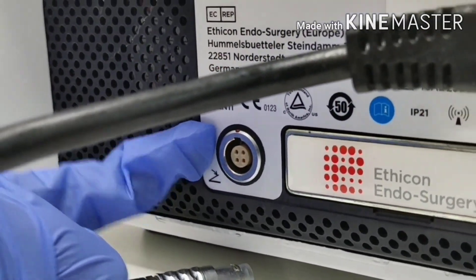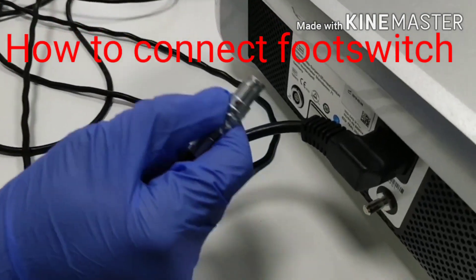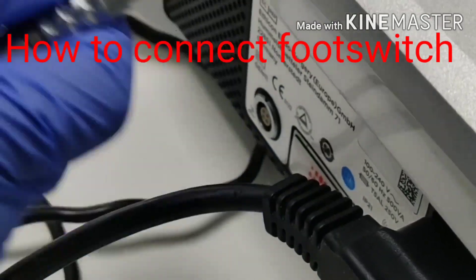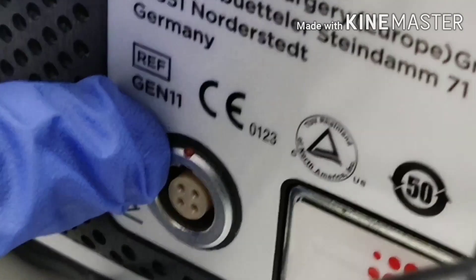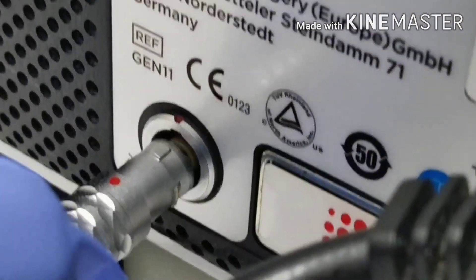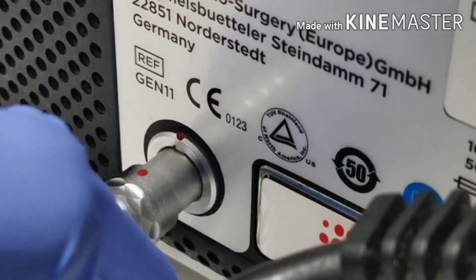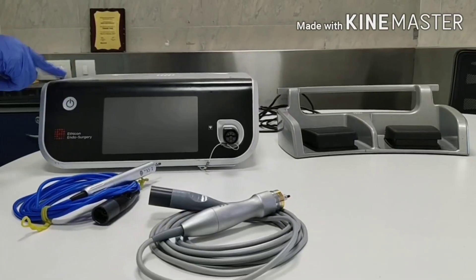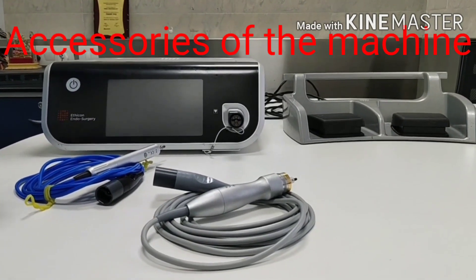And this is the footswitch connection connector. To connect the footswitch, you can see that a red dot is here and one red dot is here. Match these two dots — there is also a notch. Connect it and a click sound will be heard. This machine is used in laparoscopy cases and open surgeries.